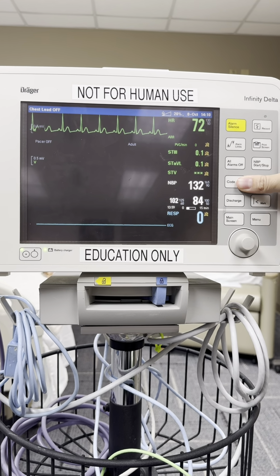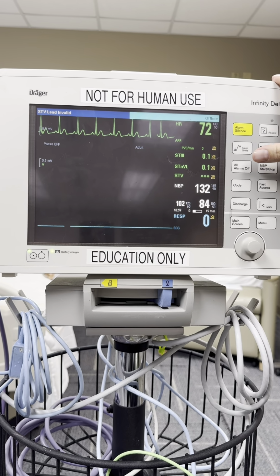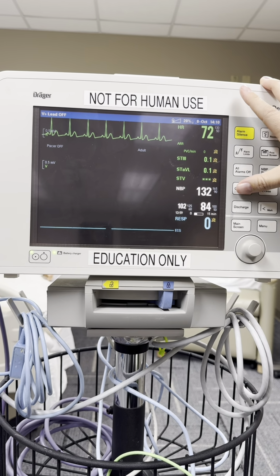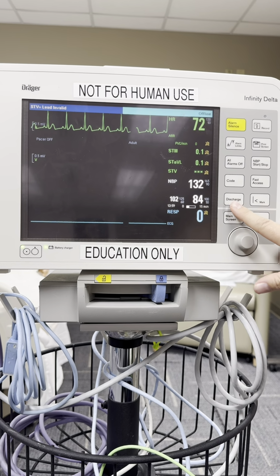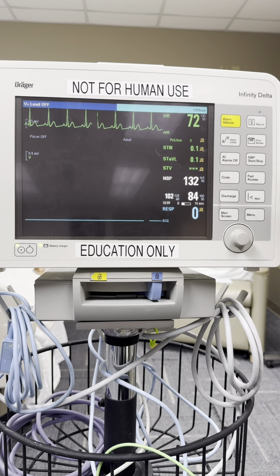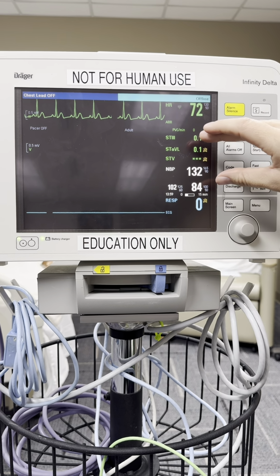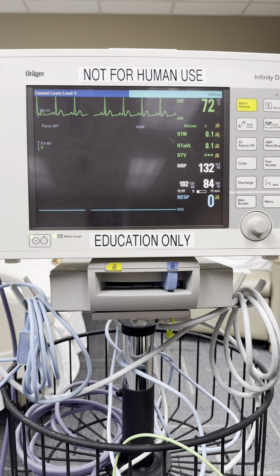The code button, if you press this, it will start a timer, and it also turns all alarms off. Don't use this just for a timer because it can miss things, but you hit it and then you'll hit it again to turn the code off. There's a discharge button here that you can hit instead of scrolling through the menu. The print screen button, if your patient's in an arrhythmia and you want to catch that, will basically just take a screenshot of what is on the screen at that moment, and it will print it to the printer on your unit.